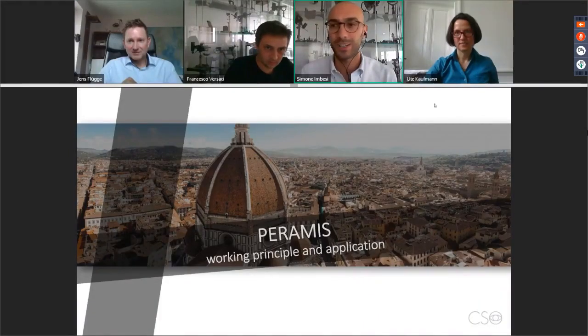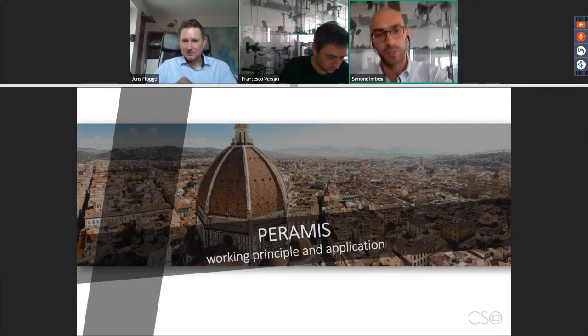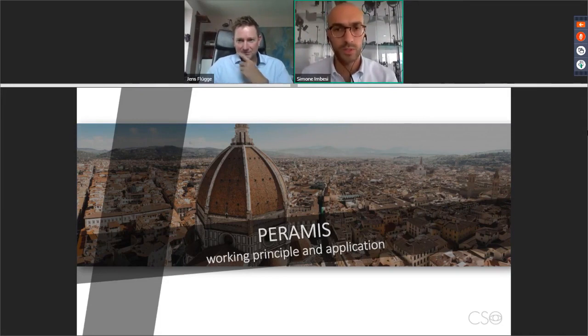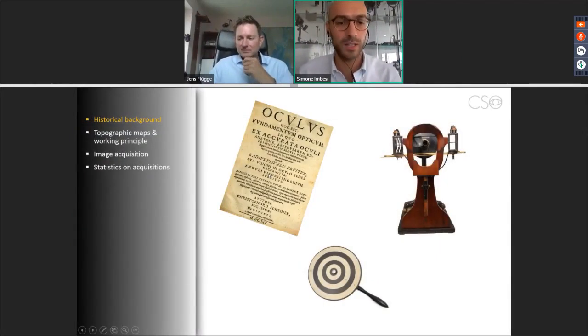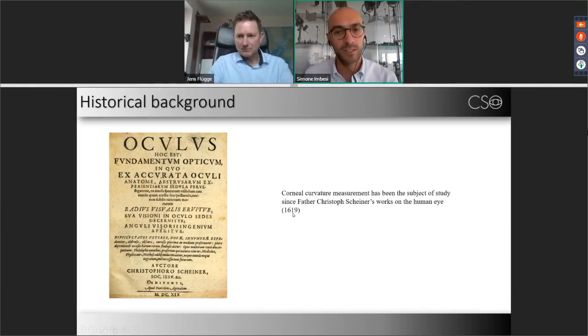My colleague Francesco talked about corneal total aberrometry. I'm going to talk about the topographic part of Peramis. So first of all, let's do a little historical background. We know that the first document reporting the study of corneal shape was dated 1619, and here Christoph Scheiner, for the first time, studied the corneal surface as a reflecting mirror.